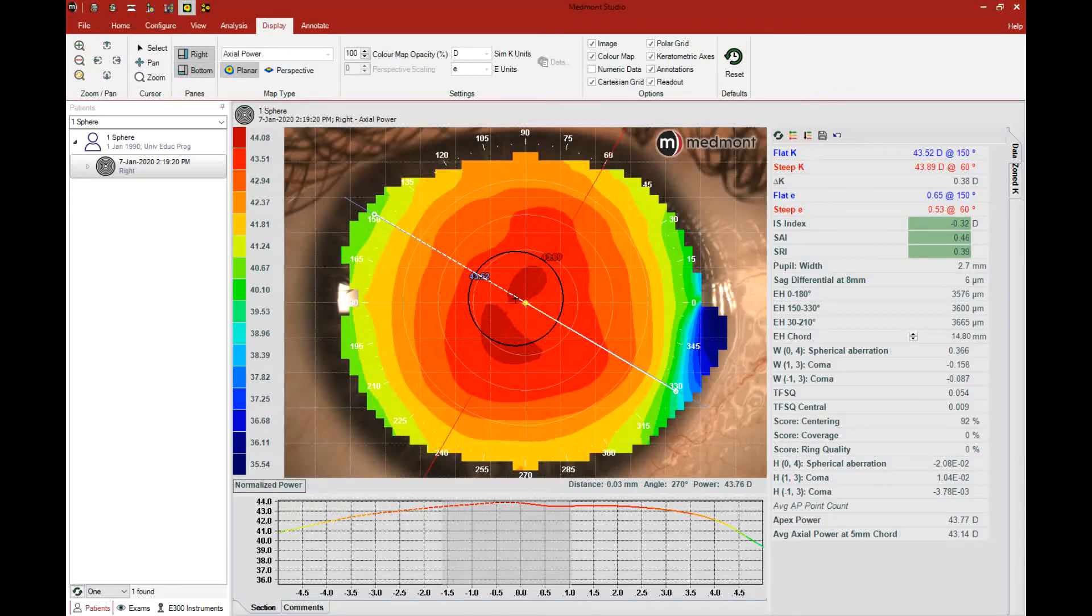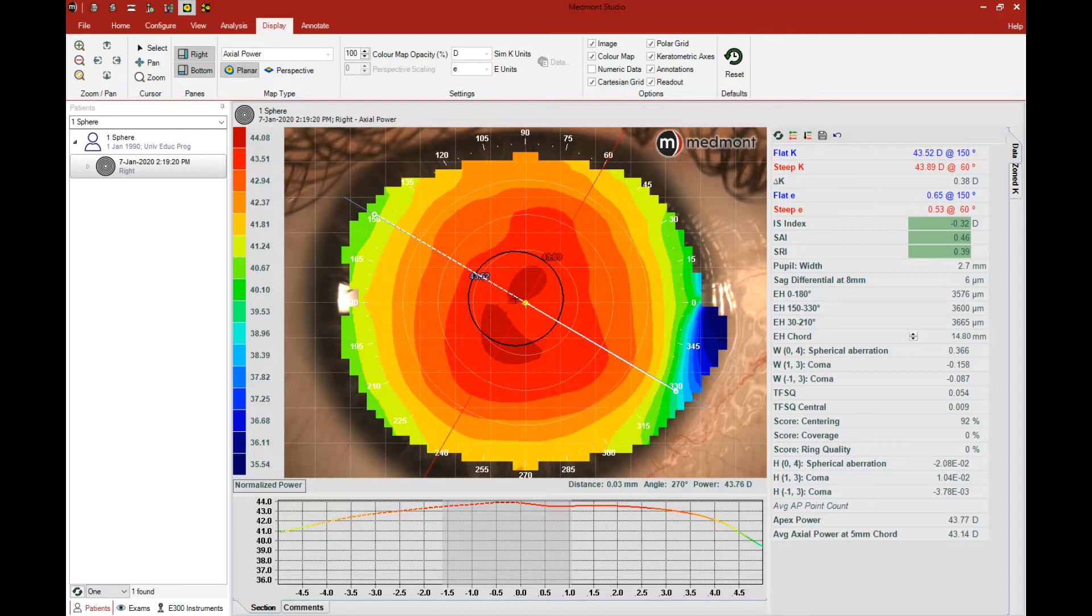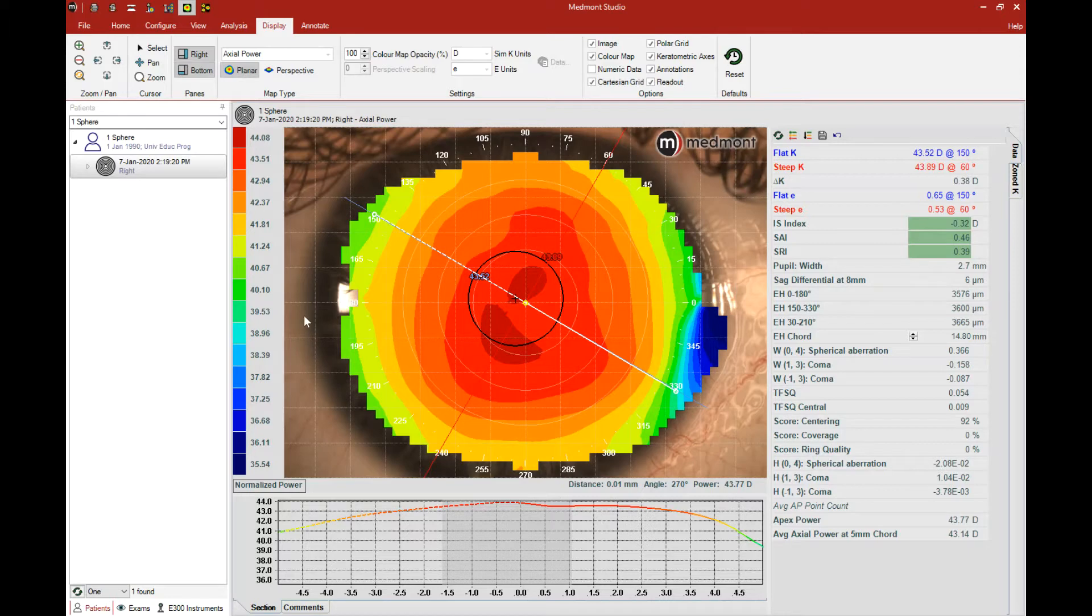This video describes the process of determining visible iris diameter with your Medmont topographer. To begin, click on a topography and observe whether you can make out the border of the visible iris diameter 360 degrees around.